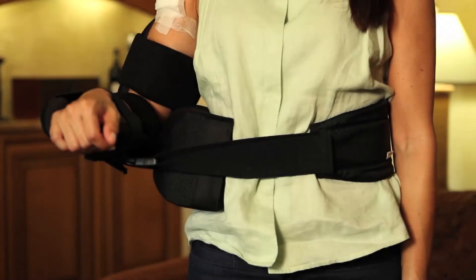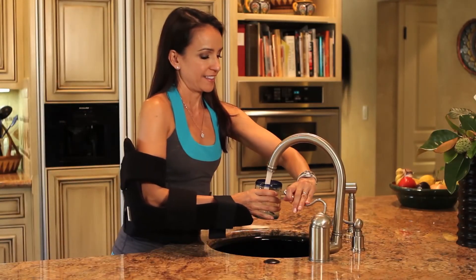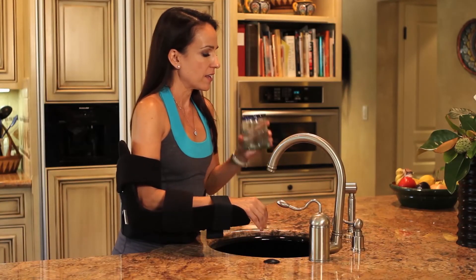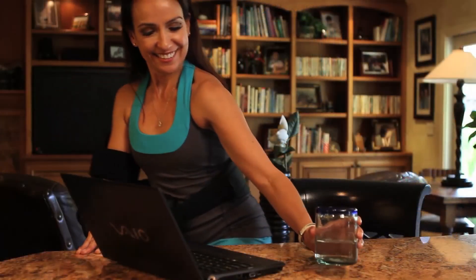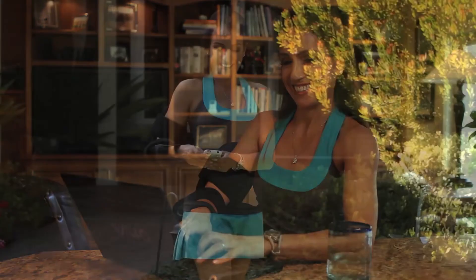The shoulder cradle is designed to maintain the shoulder in a position of neutral rotation, which is not only the optimal position for proper healing, but also beneficial for carrying out the activities of daily living, such as getting a glass of water, using a computer, and using mobile devices.